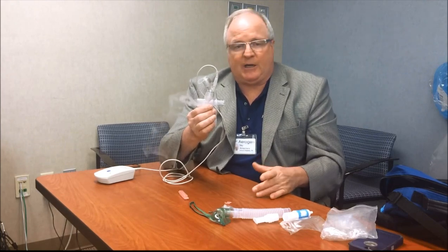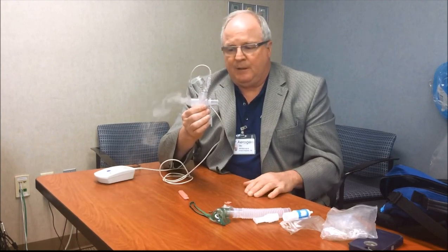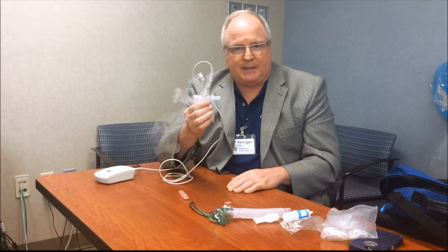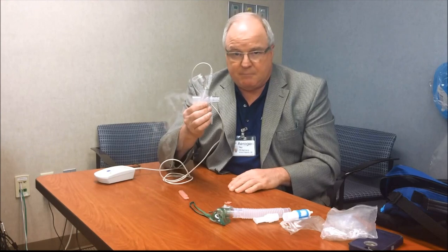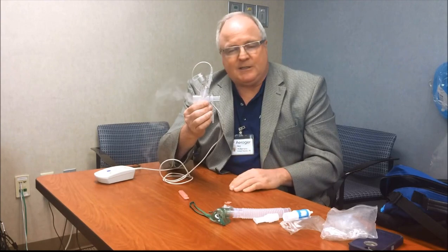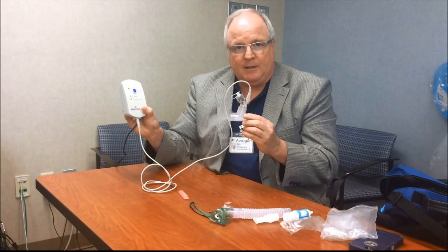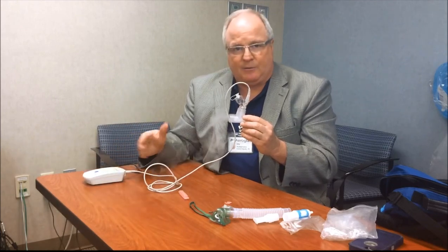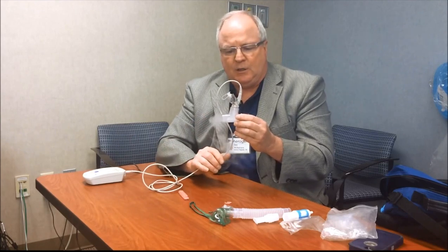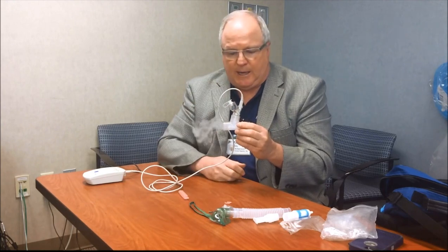You can actually do a vent check while this is in line, and or a blood gas, because again, we're not changing the FiO2 at all. The main thing is just to make sure that you see aerosolization. The treatment should last anywhere between 5 and maybe 8 minutes, depending on the volume you're using. The main thing is that once you've depressed it once, it automatically went to the 30-minute. So if you're unable to get back, or just basically forget to turn it back off, it will turn itself off after 30 minutes. There is no harm done if it's completely dry and it's still running, so that's not a concern at all.